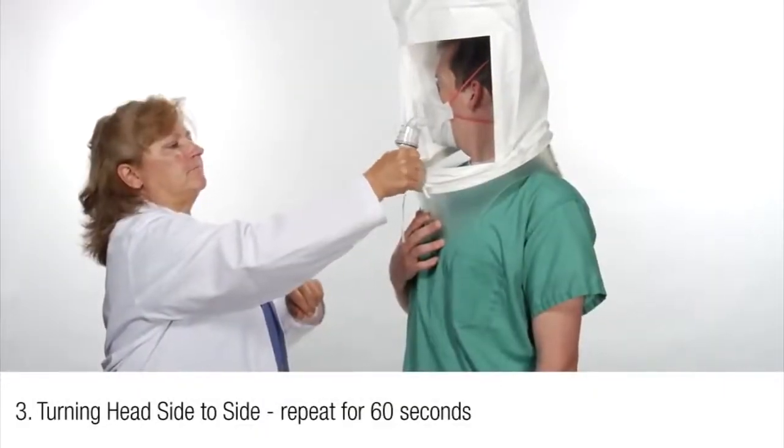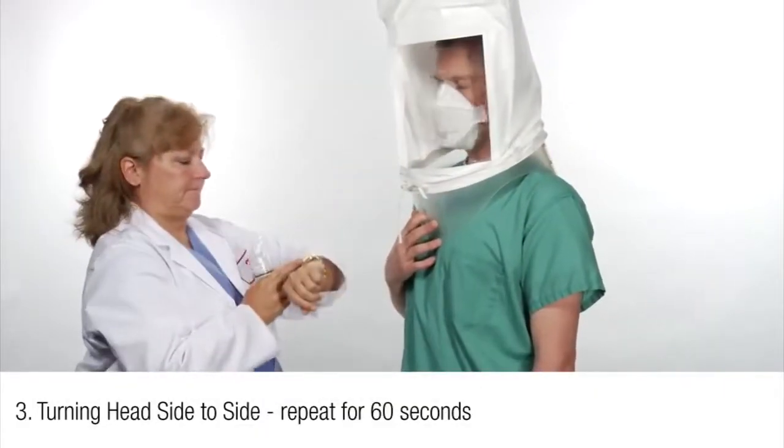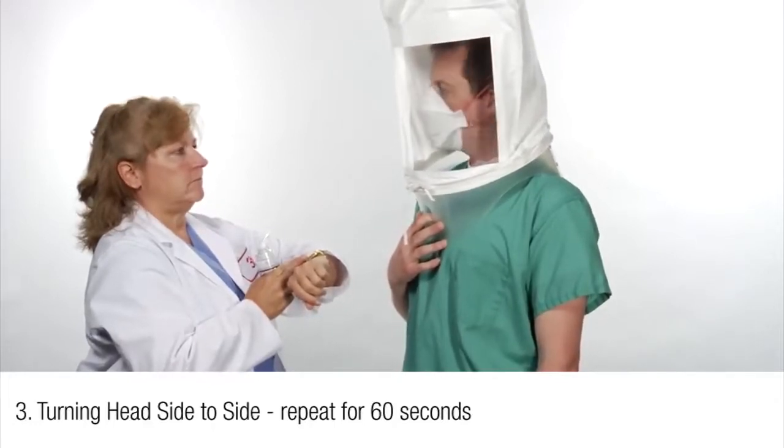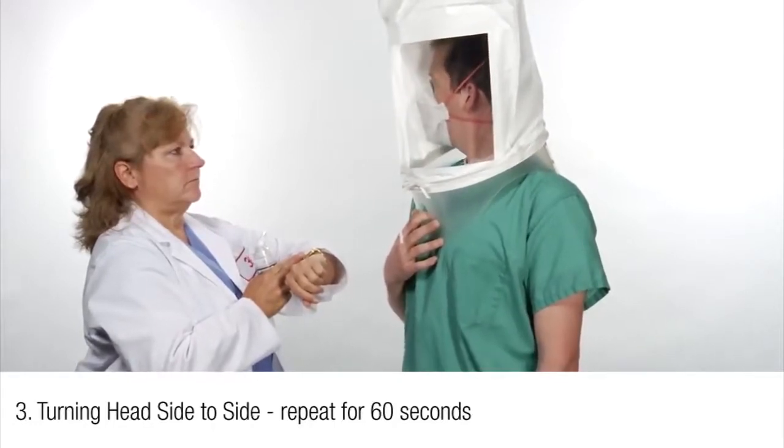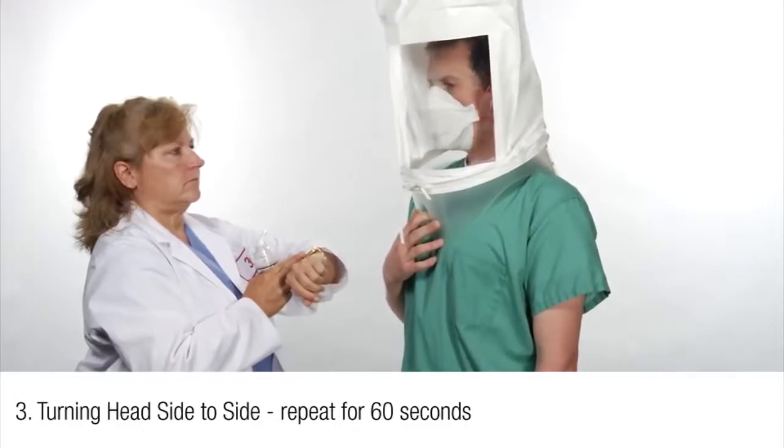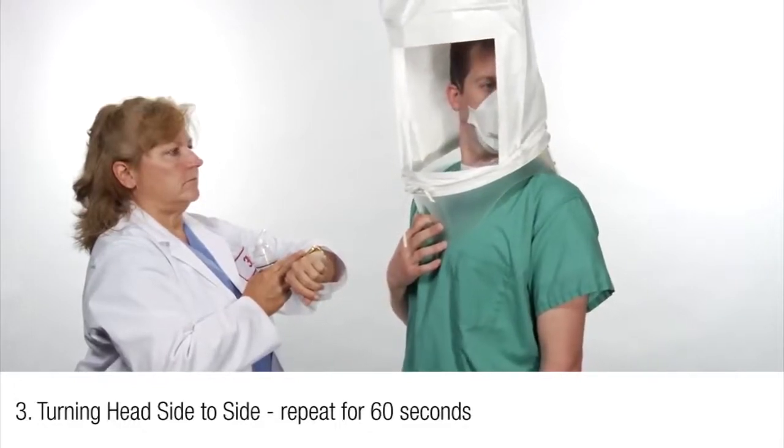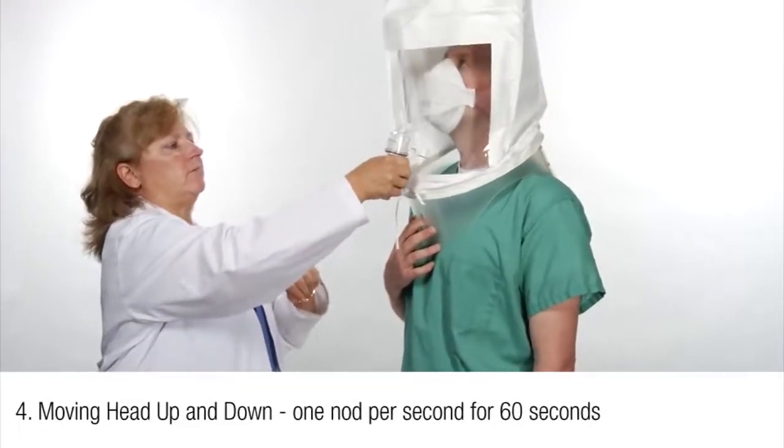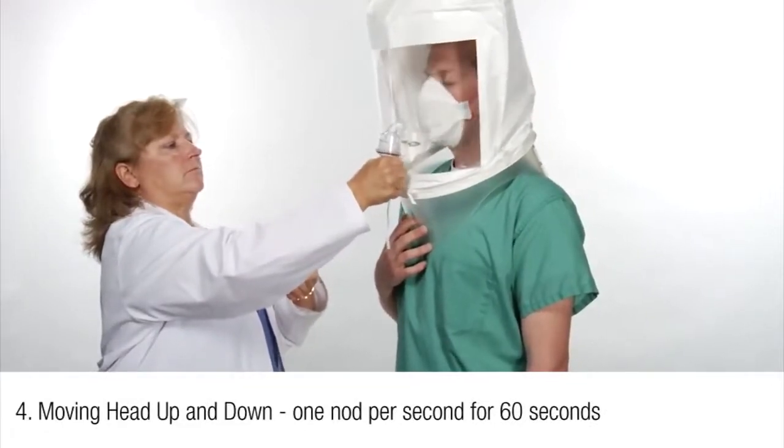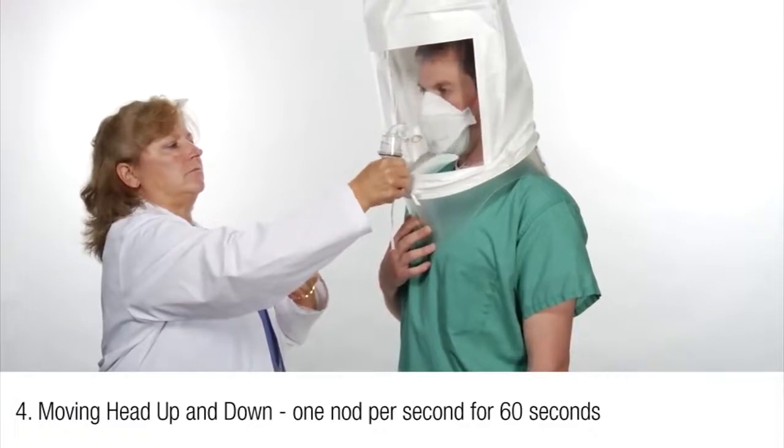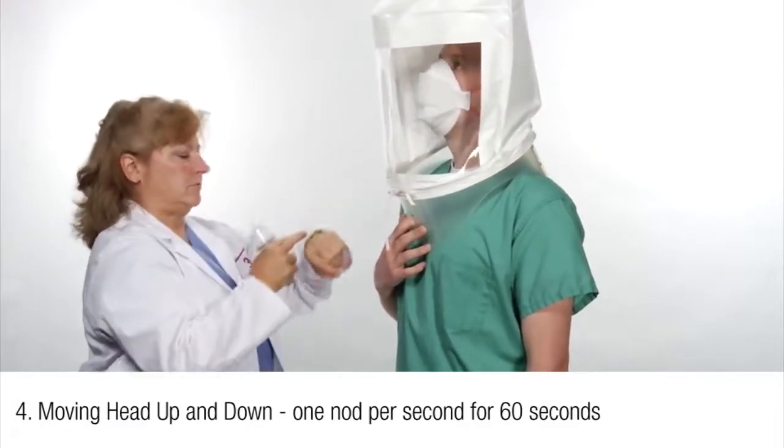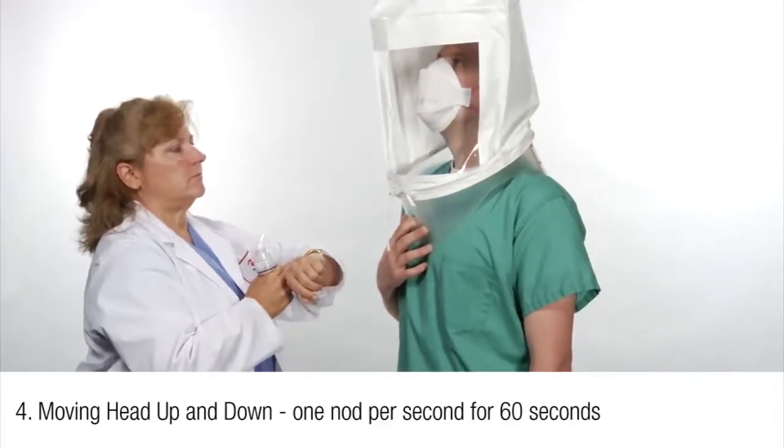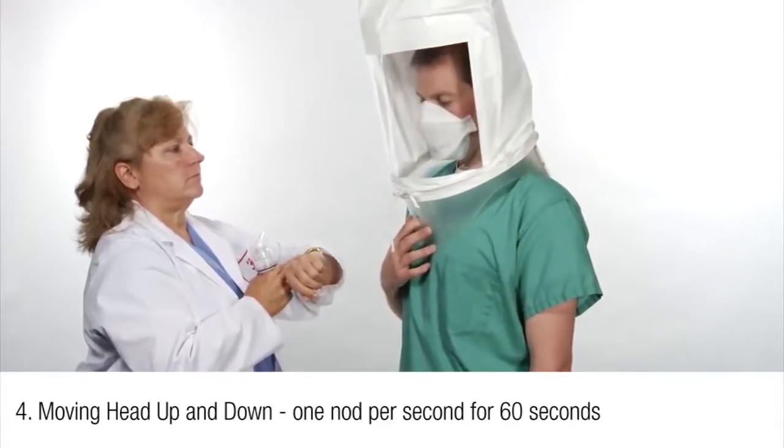Third, standing in place and breathing through their mouth, the subject shall slowly turn their head from side to side between the extreme positions on each side, pausing momentarily to inhale at each side. Repeat for 60 seconds. Fourth, standing in place and breathing through their mouth, the subject shall slowly nod their head up and down with about one nod per second for 60 seconds. Instruct the subject to inhale in the up position when they are looking toward the ceiling.